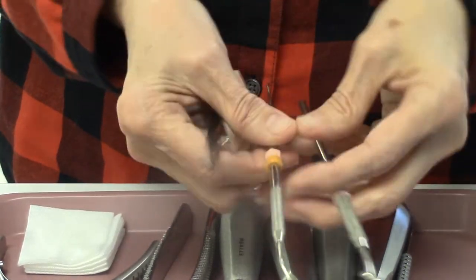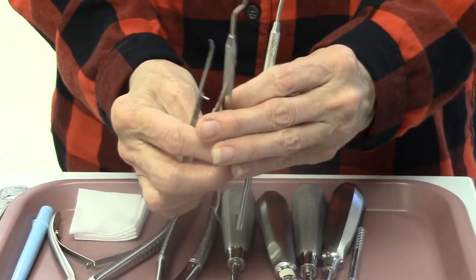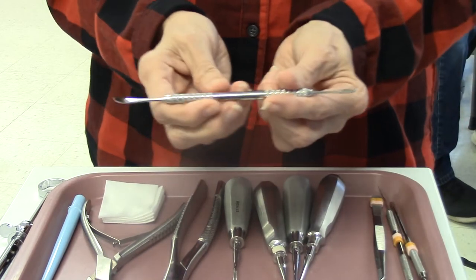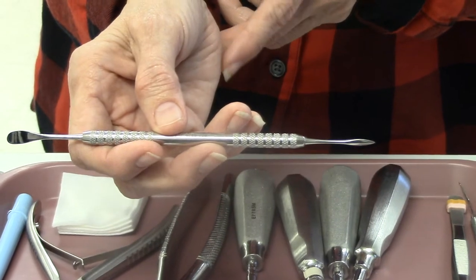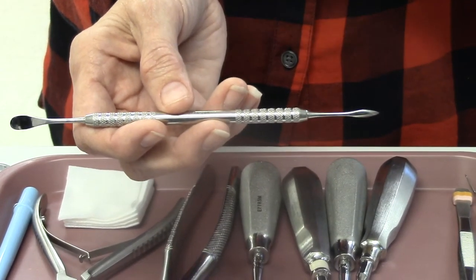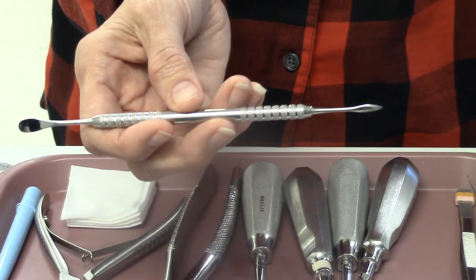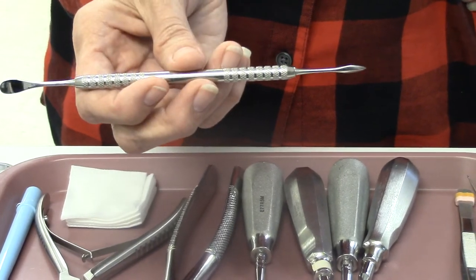In our basic simple extraction we always have a basic instrument setup which is our mirror, explorer, and cotton pliers. We also have the most important instrument on our tray, which is called the periosteal elevator. The doctor uses this instrument first to move the gum tissue away from the tooth in order to reduce and release the periodontal ligament.